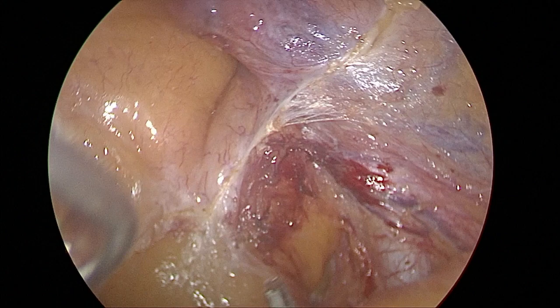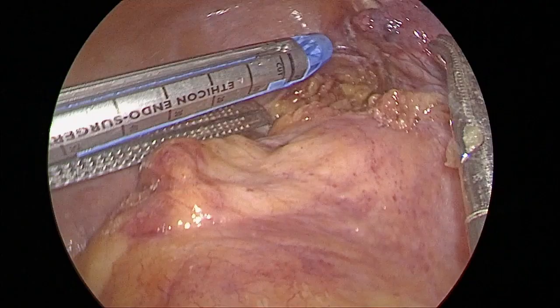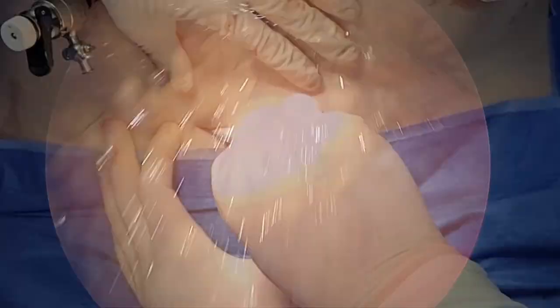The rectum is dissected and prepared for section. The distal division is performed using a linear stapler inserted through the 12mm trocar positioned in the left iliac fossa. The sigmoid colon is then completely liberated, and despite the inverted image, every effort is focused on preserving vital structures.